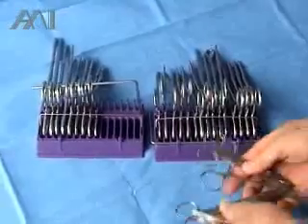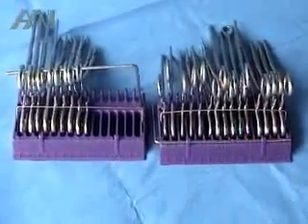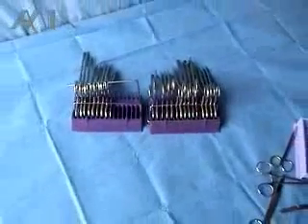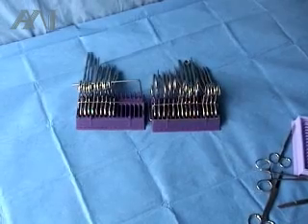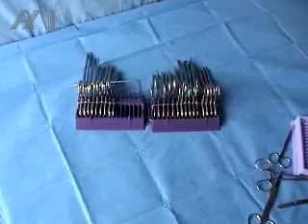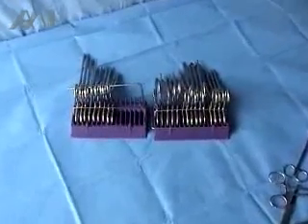You can basically detect four instruments on the back table and two instruments on the Mayo, and you have essentially counted six instruments instead of 30. That shortens the cycle time of counting instruments two or three times during the case and assists in the quick turnover of the surgical suite.